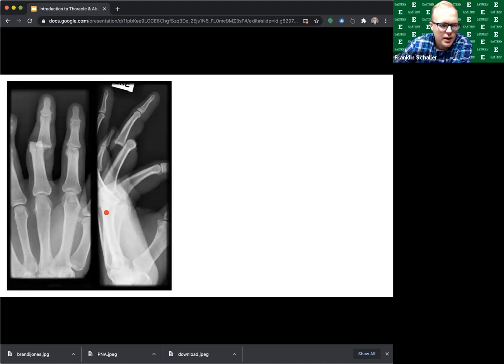Another example, 59-year-old female fell on the last step of the stairs while coming down, caught her finger on the railing, and now has pain in her middle finger. On exam, has an obvious deformity of the right middle finger. How's that x-ray look to you guys?